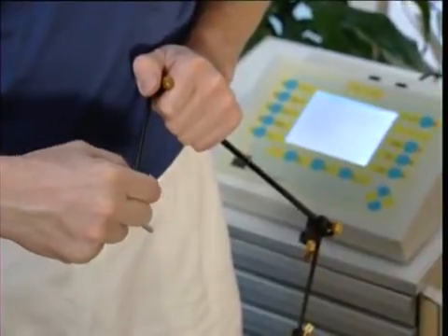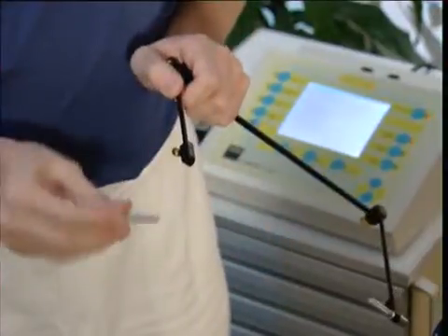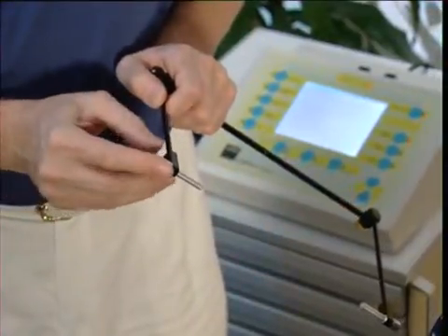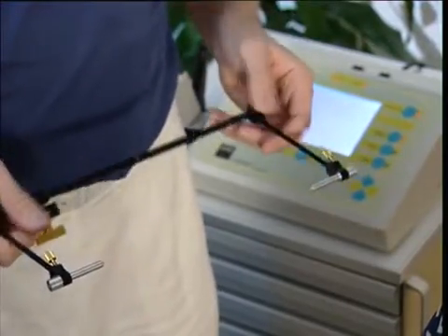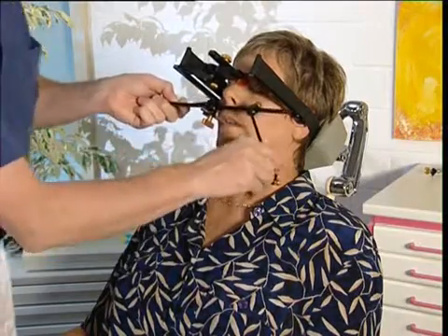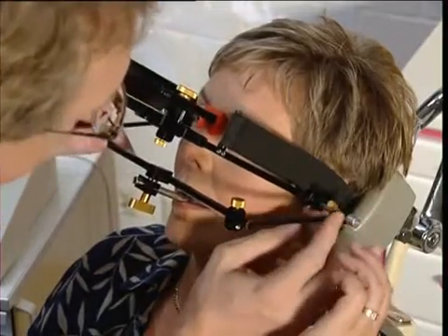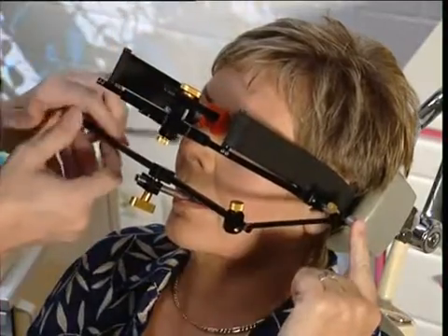The fitting tool is fitted to the mandibular tracing bow to adjust the side arms to the correct distance for the electronic styluses. The 4-wire connector is then slipped onto the tray handle. Both side arms are placed in the arbitrary holes in the tracing plates. The patient is asked to hold this position by hand.